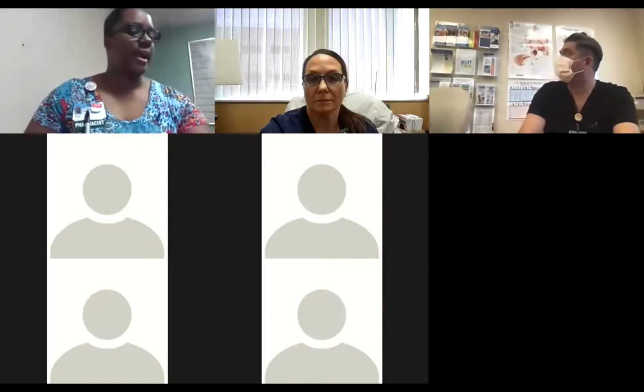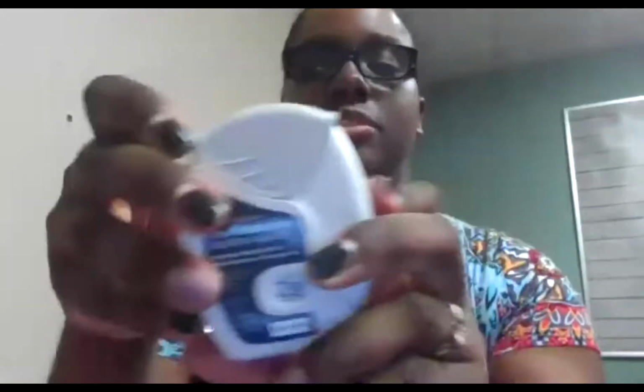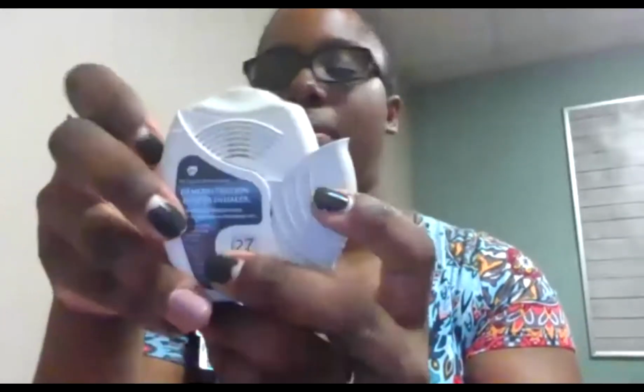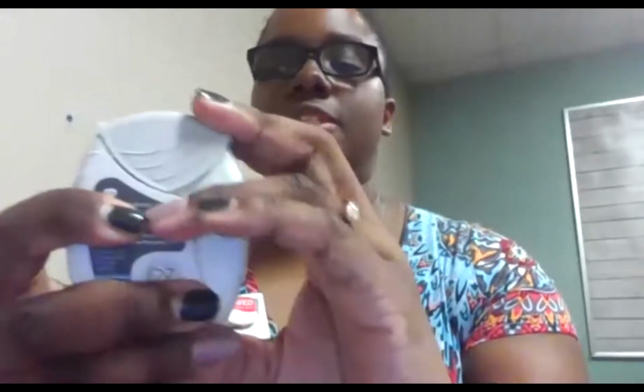The next one I have is an Ellipta inhaler. So this would be your Anoro inhaler. That's the one that I typically see. There are other inhalers that have this style, but it works very similarly to the Diskus. So you're also going to make sure that it's in date. And then the way you activate the dose is by pulling this down, and then you hear a click, and then your dose is activated.